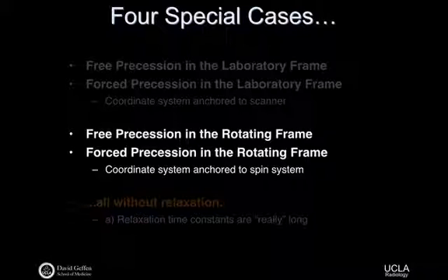Okay, now we have to talk about the B1 rot here. In the rotating frame, we still have two fields. We have to take account for the B0 field and the B1 field. Remember, this is mathematically convenient. It's a fictitious field. It doesn't really exist. It makes things convenient for us. Now we have to talk about what actually exists, and in terms of what actually exists, we have to talk about the B field in the rotating frame. We know the B0 field in the rotating frame just looks like B0 along the K hat prime direction because that K direction is shared, nothing new.